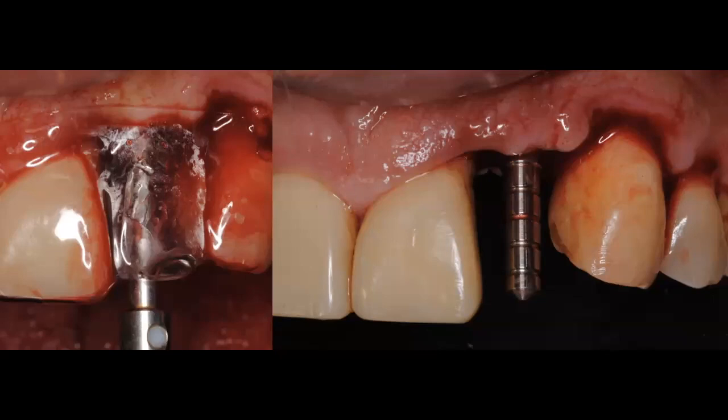So there's two things that you can do. First and foremost, I'm going to look at the pin and see, am I equal distance between the distal of the central incisor and the mesial of the canine? Then I grab that clear matrix and I put it right on top of the paralleling pin. The paralleling pin will come out literally through that little access hole that you created on the lingual. And now I want you to look at the facial aspect of that clear matrix and the lingual aspect of the clear matrix, and you're going to ask yourself, is this pin centered buccal lingually? So if you feel and you know that you're centered, you know that you're in the right position.